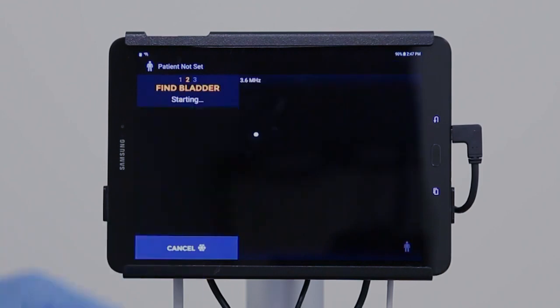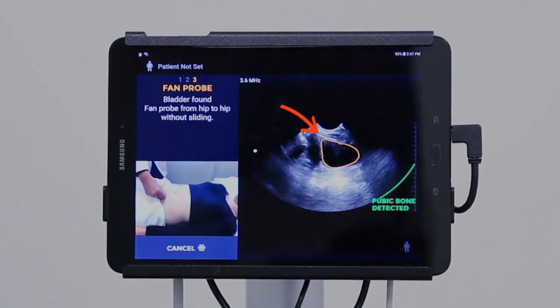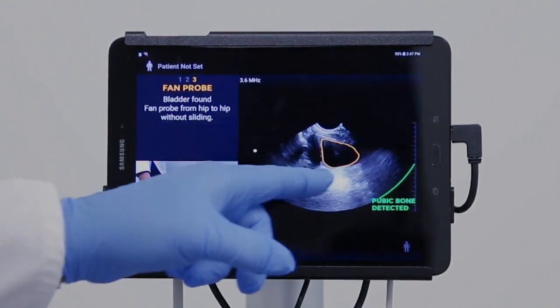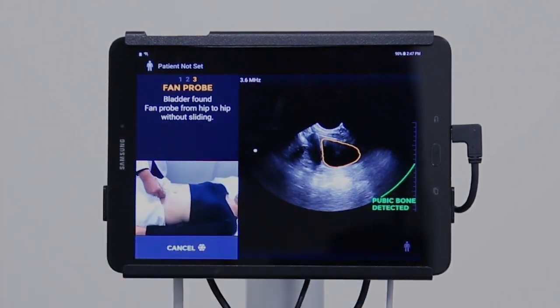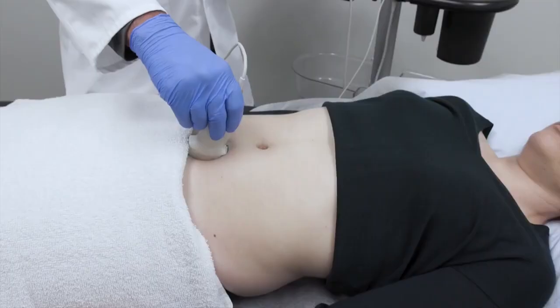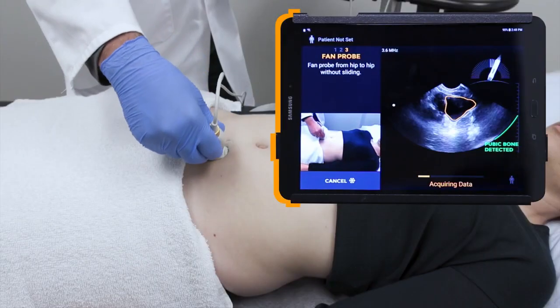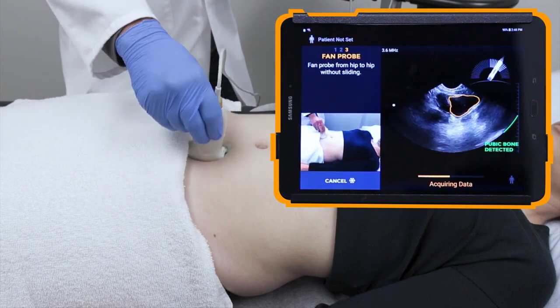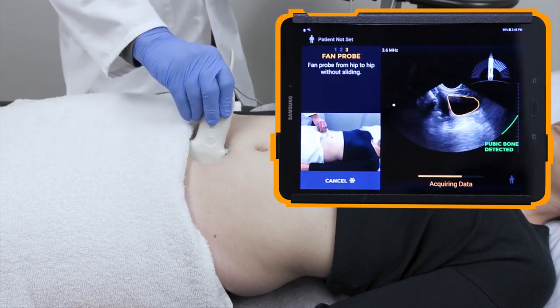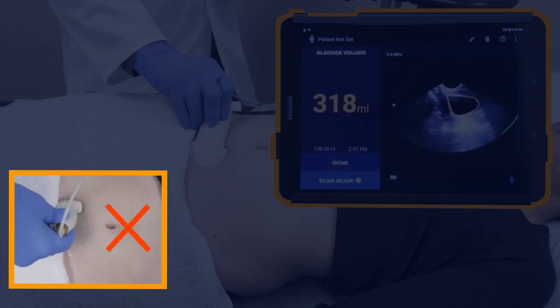Select Scan. When the bladder has been found, an orange outline will appear around the bladder. The pubic bone indicator will appear as a green curved line. Maintaining pressure and angle, fan the probe towards one hip until the sound indicator is heard and the arrow appears. Then fan back towards the other hip until a second sound is heard. Make sure not to slide the probe while fanning.